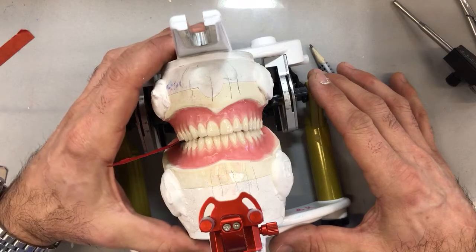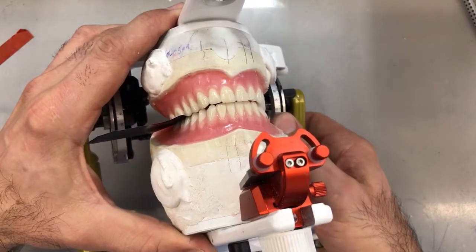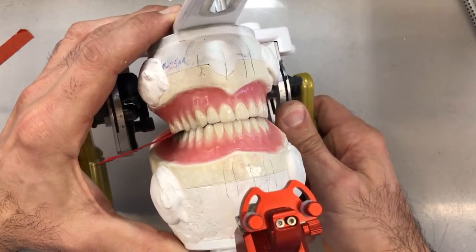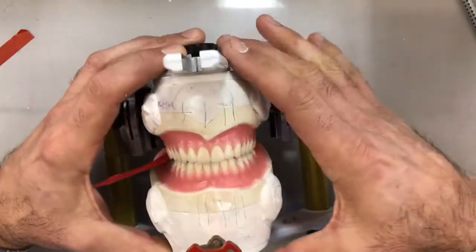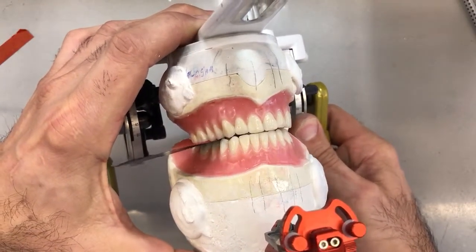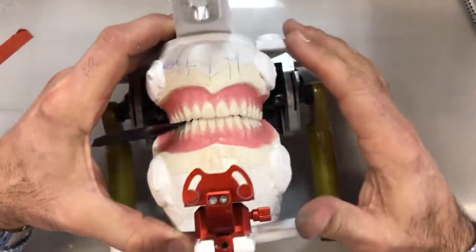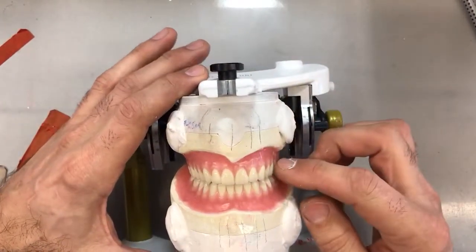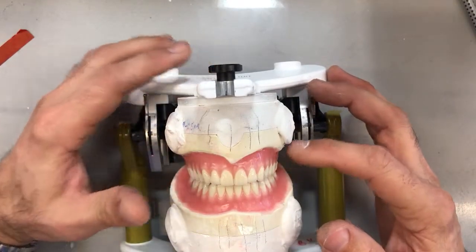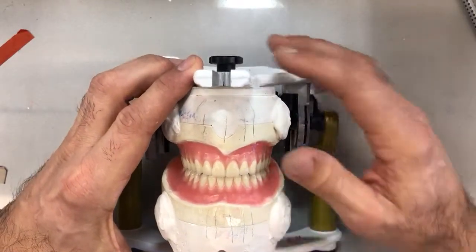I'll apply a little pressure with my left hand, squeeze the articulator together, and shift it over to the right working side to see what comes up. I'll move it between the fours now, squeeze it together, and bring it over. I can certainly feel some interference — I don't have a smooth transition of the articulator moving back and forth. I'll check the balancing side as well, but since I don't visually have any contacts there, I won't bother yet. Once I get this working side to close a little better, I'll start checking the balancing side too.